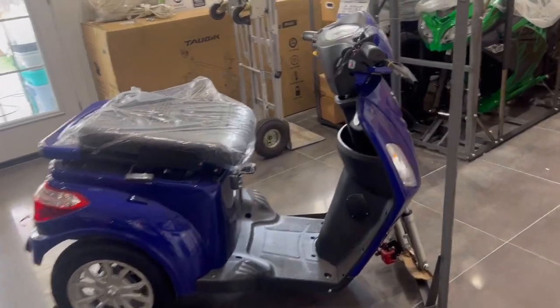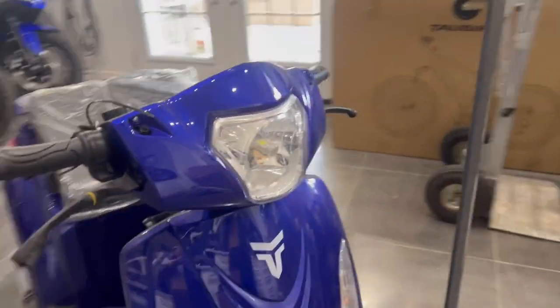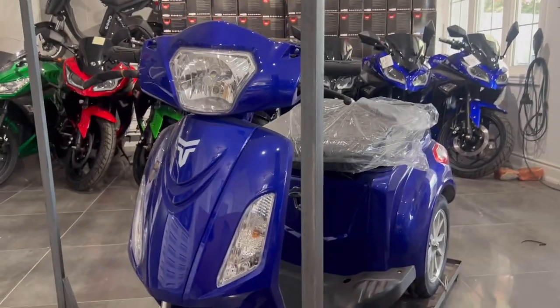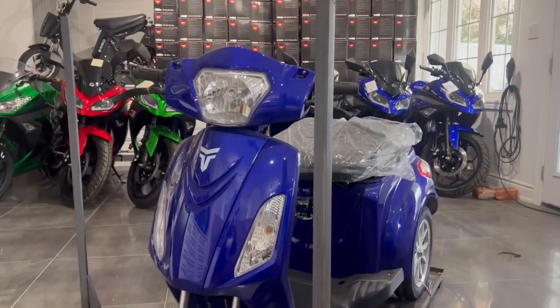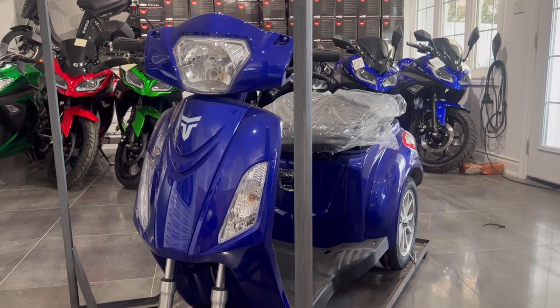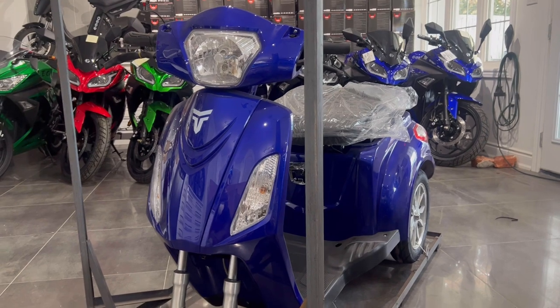Jolene and Darren from Ride the Winds. This is our best-selling mobility scooter — it's the Tau Freedom Plus, because it's got three wheels. We ship these across Canada and they're pretty easy to put together, so this is your how-to.